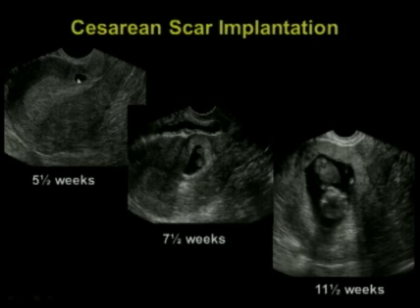We suggested this woman be treated. One of the possible treatments is to inject potassium chloride or methotrexate into the gestational sac, but the woman declined. When she came back 2 weeks later, you can see it's grown, there's an embryo, but now it's starting to bulge that surface.